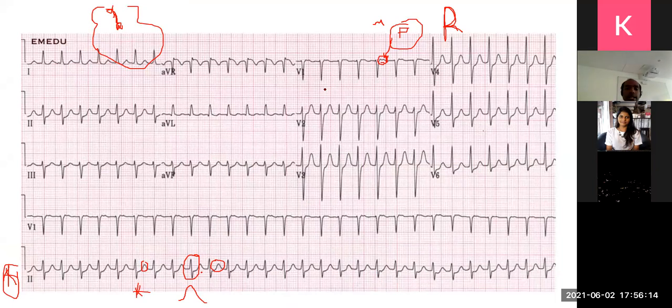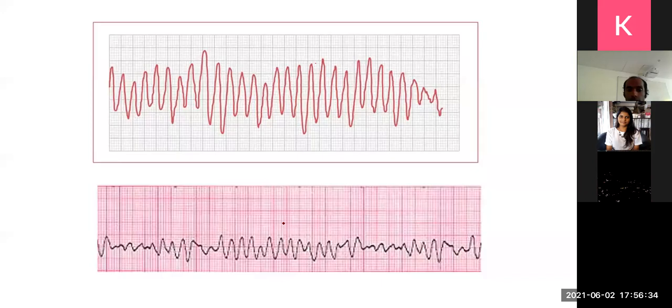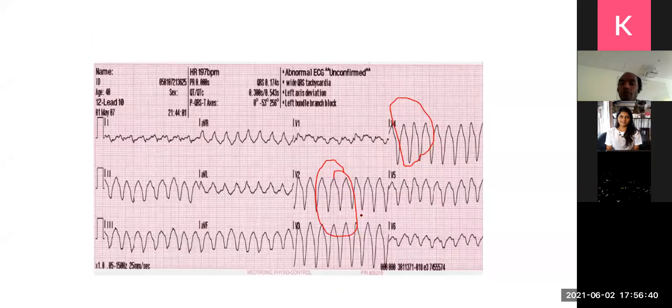Okay, what is the rhythm here? Here you can see මේ QRS එක හොඳටම මඤ්ඤං නේද? It's completely off. Can you see that? It's completely off. Here, here, completely off. So all these three are then ventricular rhythms.